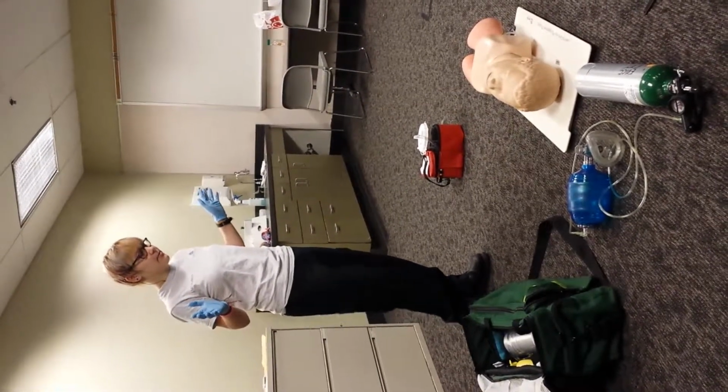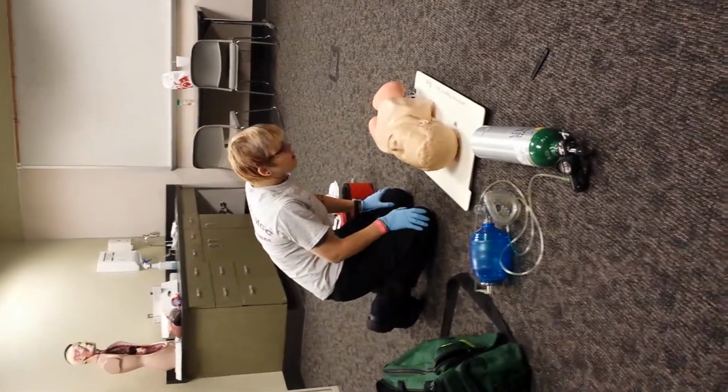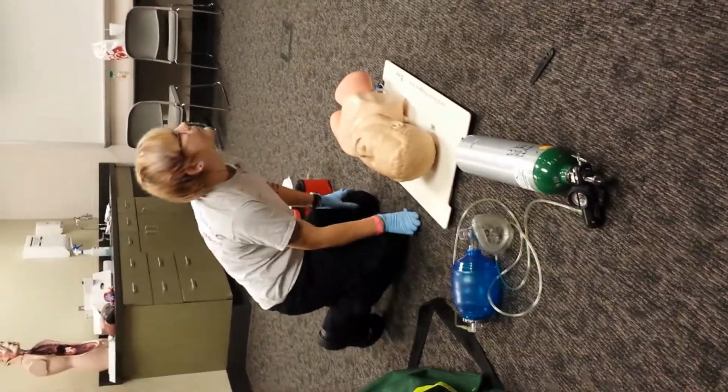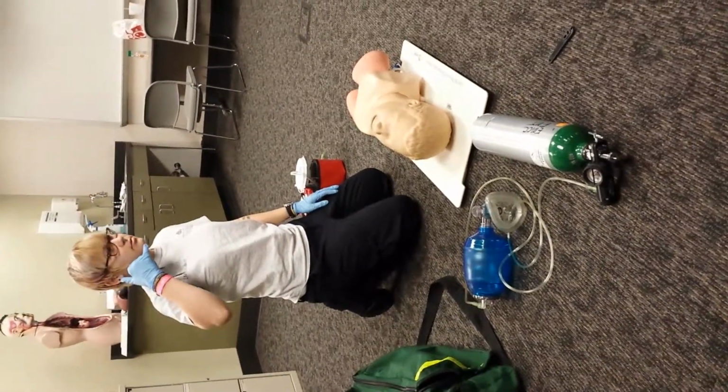BSI, scene safety. Sir, are you okay? I'm going to check breathing for 5 to 10 seconds. Rise and fall of chest. The patient is unresponsive and apneic. I'm going to call for ALS.